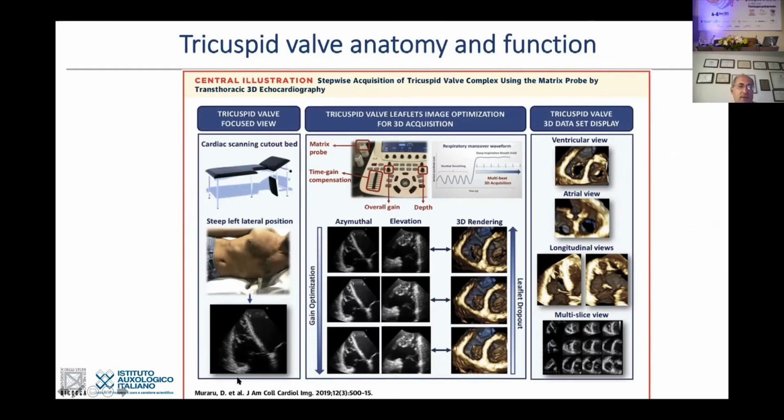This will allow you to obtain a sort of right ventricular focused view, and also don't care about the proper orientation of the view. Just foreshorten the view or go down one more, but look at the view where the leaflets are seen better. You have the best contrast.